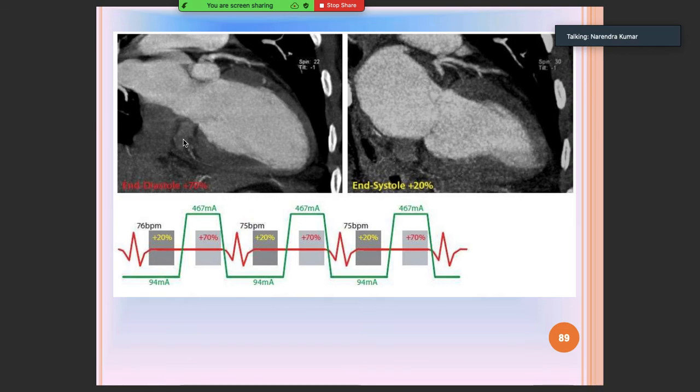So when we are reaching towards the end, we should be able to understand some of the limitations. It's a wonderful diagnostic tool. It helps us with non-invasive diagnosis, estimation of the calcium score, the coronary artery disease, and also comment about the left ventricular ejection fraction. But it does have its limitations. What are its limitations? Can someone summarize it for me?